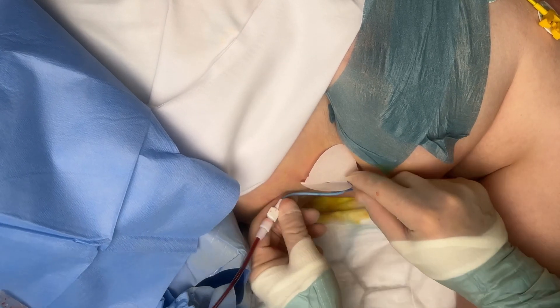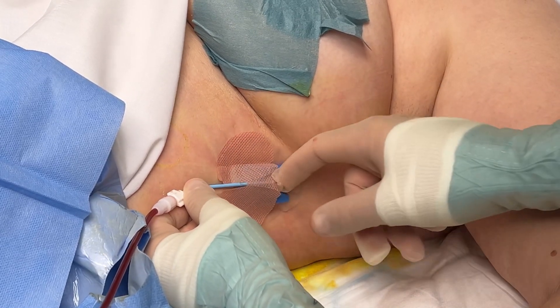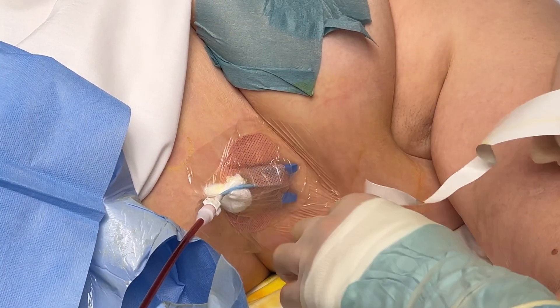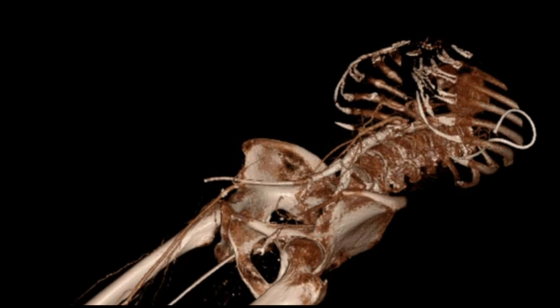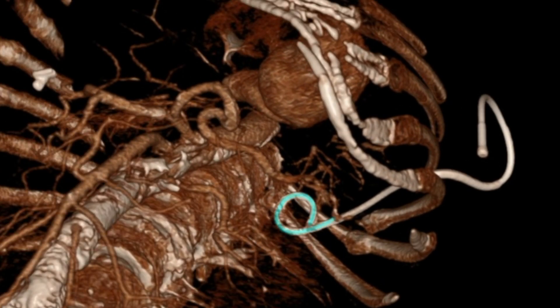Connect the drain and make sure you attach it securely to the chest wall as shown. Fasten the drainage tubing in the ventrocaudal direction, once again considering patient comfort. Secure the line with a Flexi-Track or similar device. This CT shows the tip in the optimal location — dorsal and caudal.